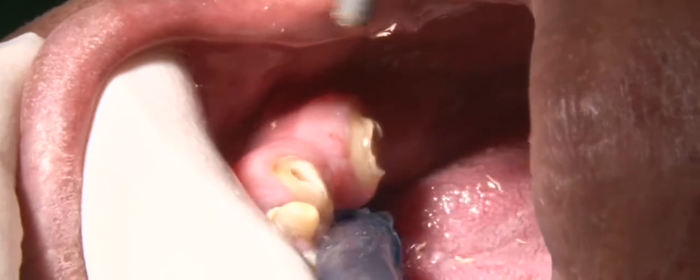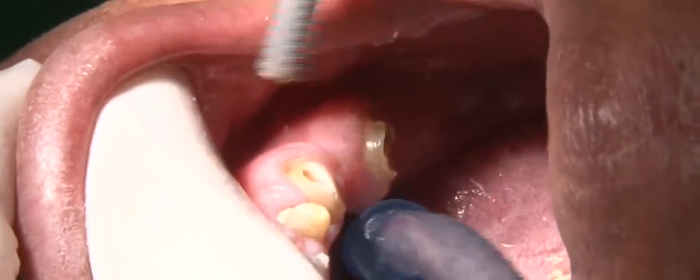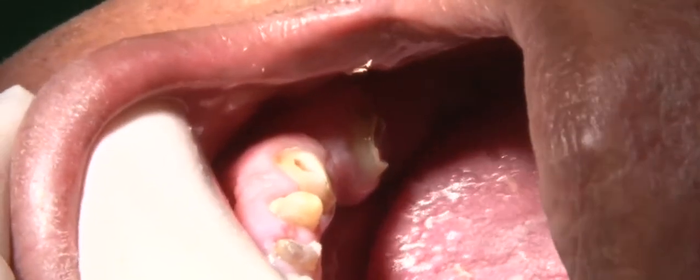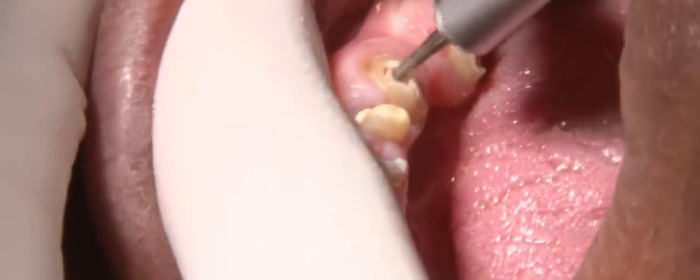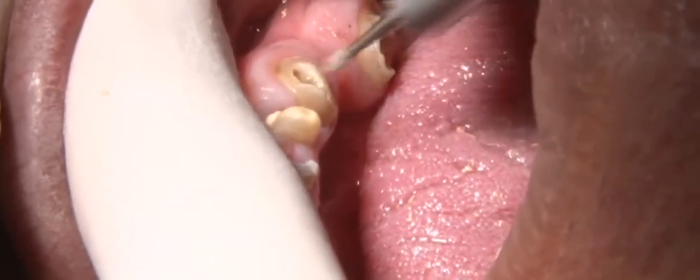Ensure that the complete gutta percha is removed from the canal in order to achieve proper bonding of the tooth to the canal. If the coronal portion of the canal space has some gutta percha, this can be removed by using a steel round burr. This burr helps in removing minimum tooth structure and hence is ideal for removing GP without causing much destruction to the tooth.